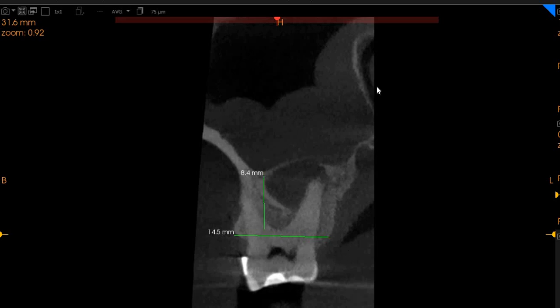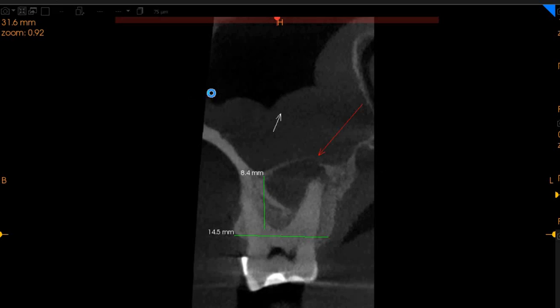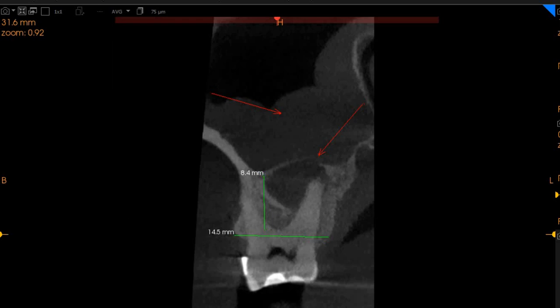Also of note is the fact that there is an opening in the sinus floor, which is causing immense sinusitis in this tooth, and the sinusitis is definitely odontogenic in its nature.